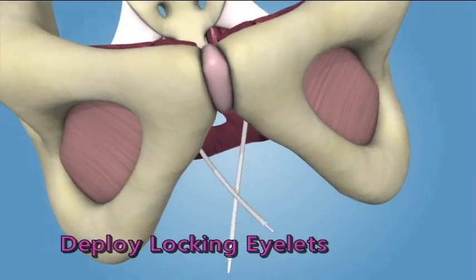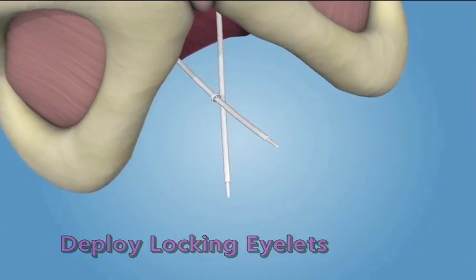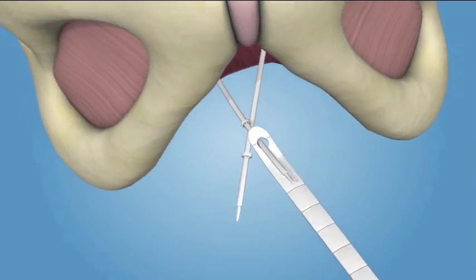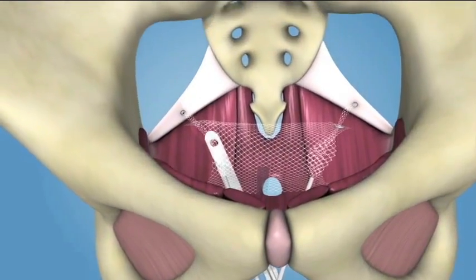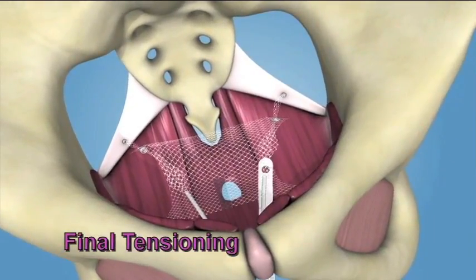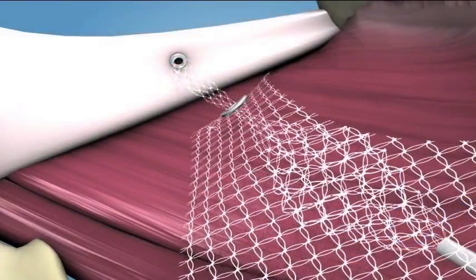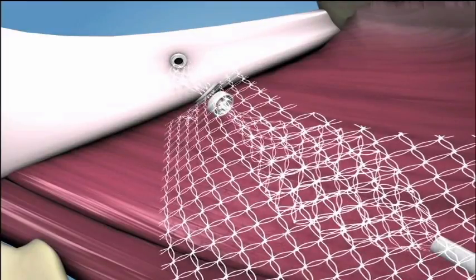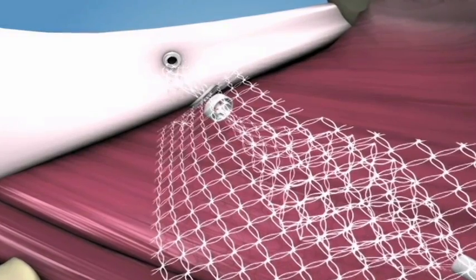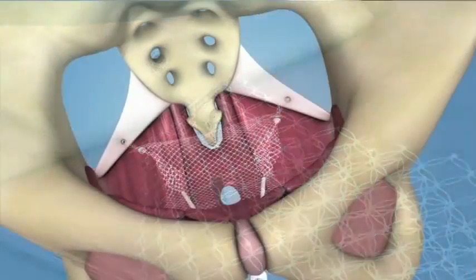Deploying the Locking Eyelets. Once final graft placement has been achieved, attach the female end of the eyelet applicator into the end of each fixation arm. Slide one locking eyelet onto the fixation arms at least 2 centimeters and disengage the applicator. Using the adjustment tool and alternating sides throughout the process, slide the locking eyelets down the fixation arms into the pelvic cavity while maintaining medial positioning within the introitus. Continue advancing the locking eyelets down the apical fixation arms until they reach the graft, and palpate to verify the locking eyelets rest against the surface of the graft.